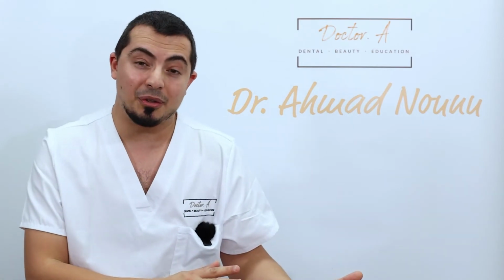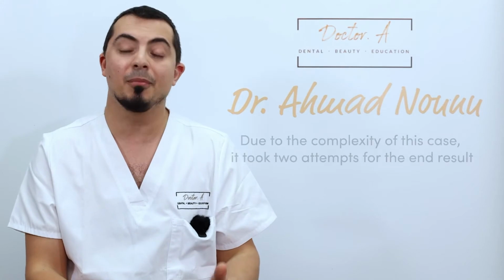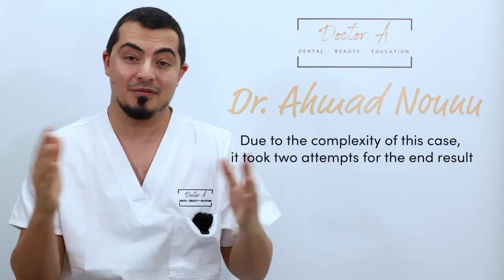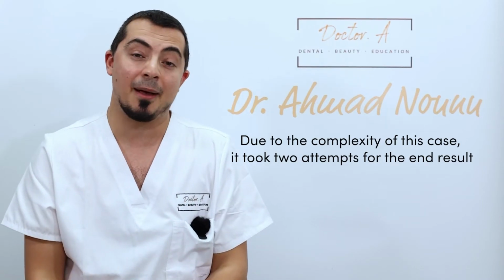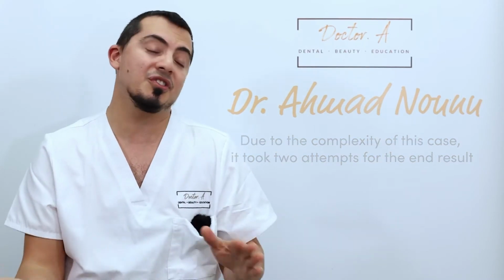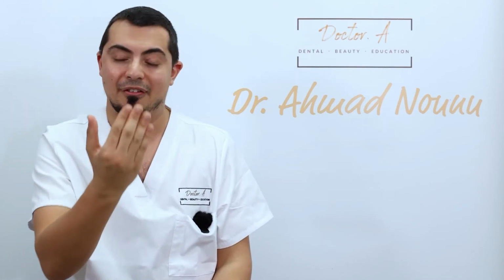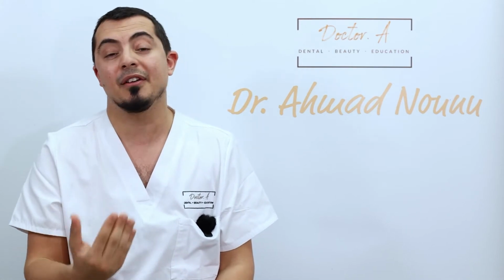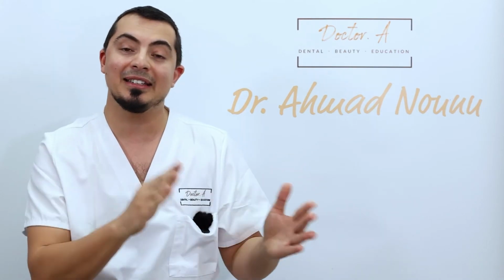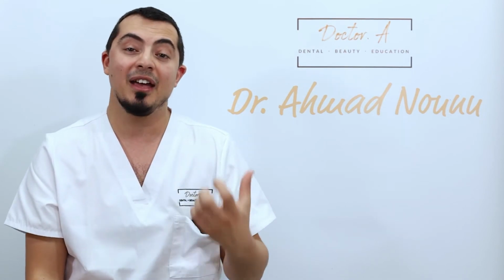This is the final crown in this particular case. We did do 2 try-ins for this one before we finished. So again, a disclaimer to admit that it took us 2 attempts to get this absolutely right. We didn't cement the first 2. We tried them in, and we took further photos that had the layering of the original layer, or underlayer, of the porcelain on there to check the colour match before we actually went to final fit.